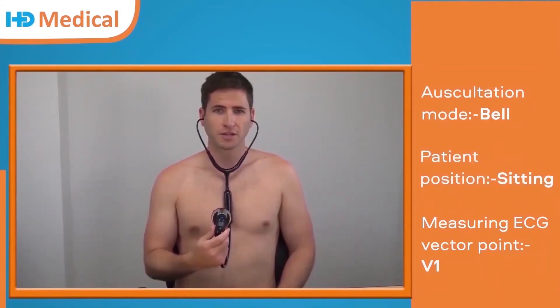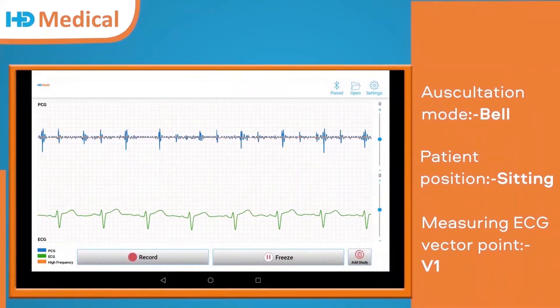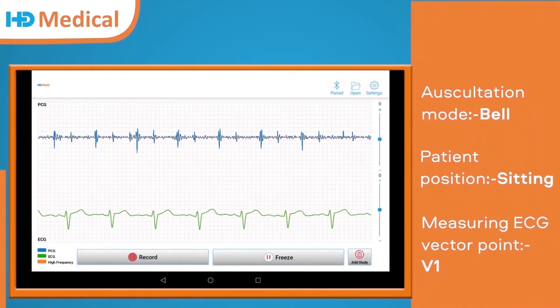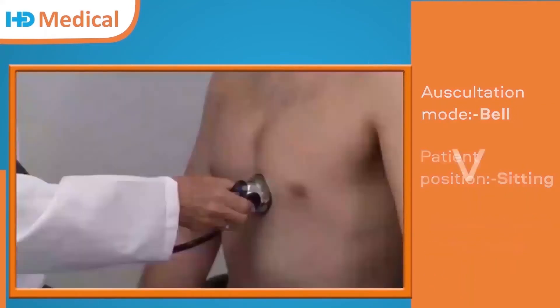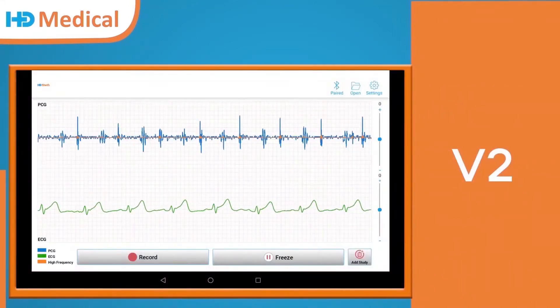Now I am measuring the ECG vector points, V1 to V6. This is the auscultation waveform for V1. ECG vector point V2. V2 waveform.